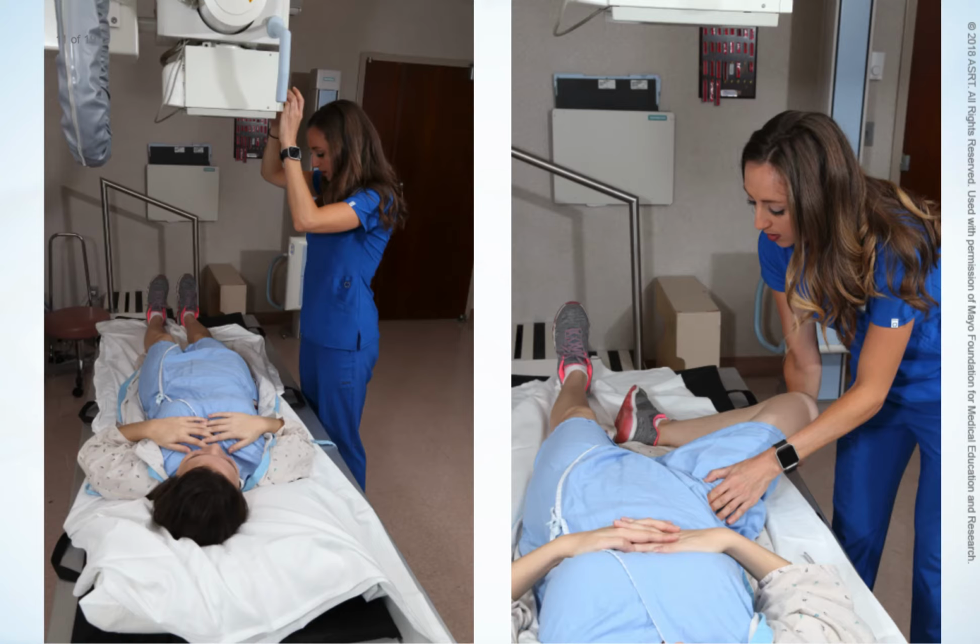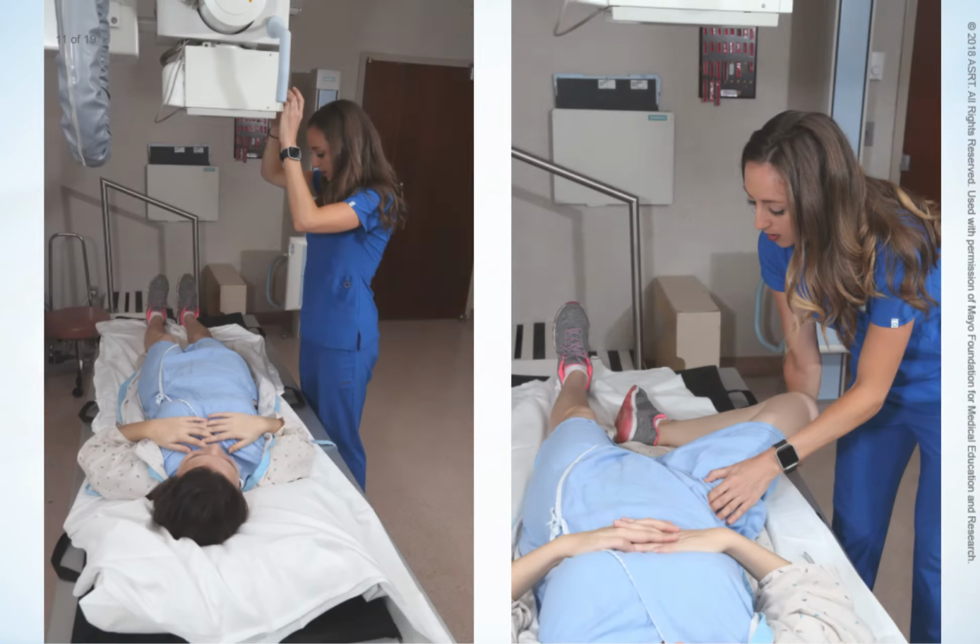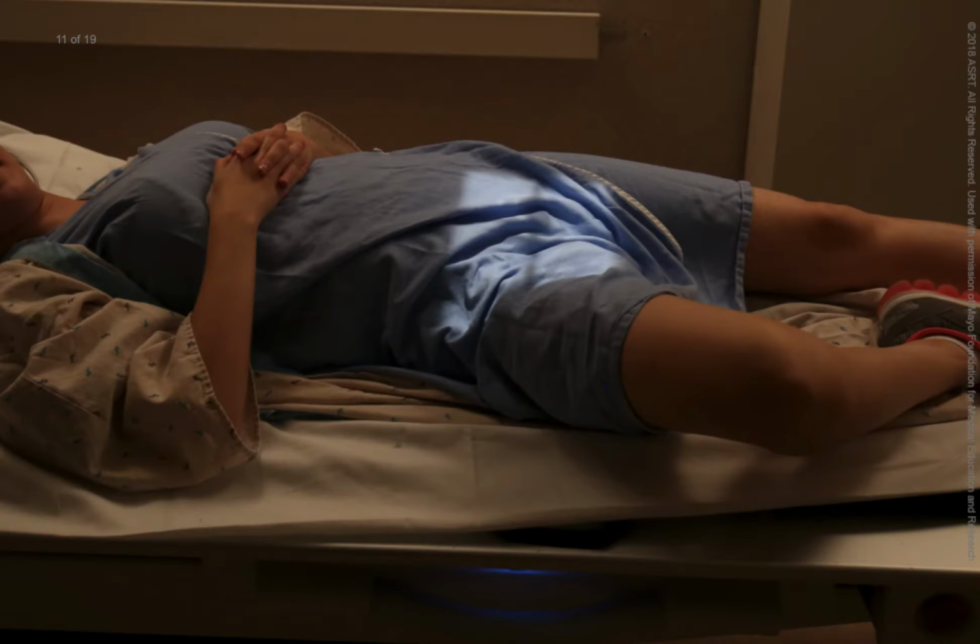Have the patient rotate slightly toward the affected side and flex the affected hip and knee, abducting the leg until the thigh is nearly perpendicular with the hip bone and the femur is parallel with the table. The patient's pelvis may be rotated slightly to accommodate this position, but the affected hip should remain free of superimposition. The hip is centered to the midline of the image receptor. The patient's opposite leg is extended, and a cushion may be placed underneath the contralateral hip and knee for support.